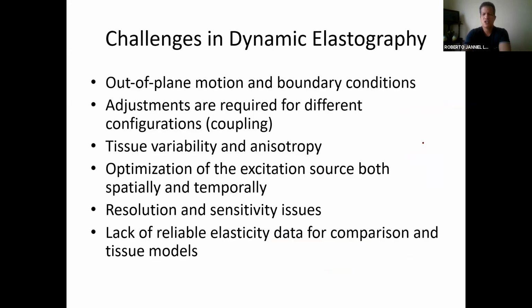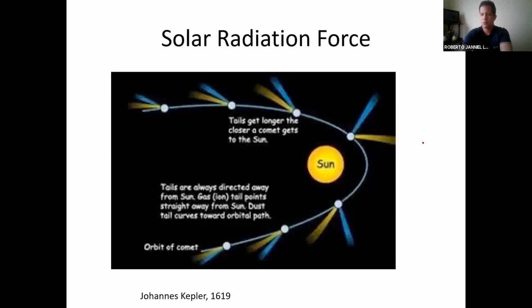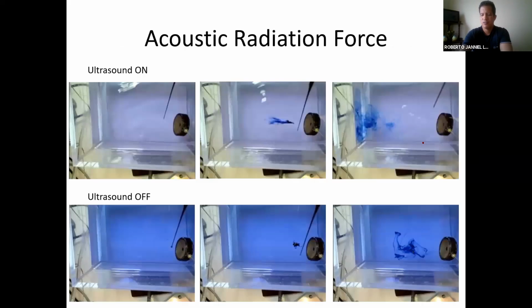And there is the issue of, okay, for these types of elastographies, again, we have a drum and we make the person vibrate, or you have a driver that's propagating a slowly moving wave. But the one that you're probably more commonly going to find in the literature is the elastography that uses acoustic radiation force. Radiation force is something very phenomenal.